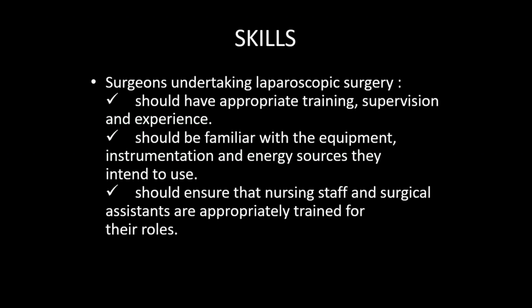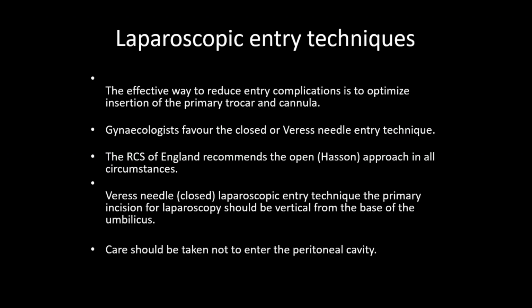For example, you should test the light source and check the Veress needle prior to inserting it, and the insufflator machine. You should ensure that all equipment is working well prior to starting, okay? And assistants should have a high level of training, and the nursing staff as well should be well trained. This is the general information. And now about the laparoscopic entry techniques.